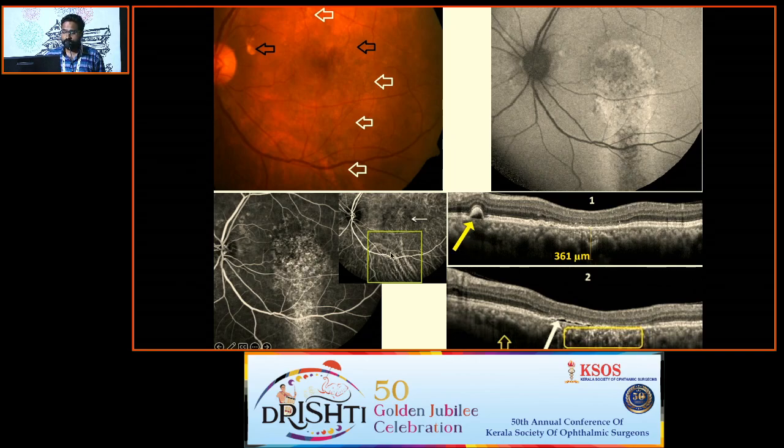Indocyanine green angiography shows dilated choroidal vessels along the tract as well as an area of hyperfluorescence in the macula. On OCT in these patients, there will be more RPE thinning, irregularity of the retinal pigment epithelium, small elevations of the RPE above Bruch's membrane, hyperreflective dots in the choroid, as well as collapse of the inner into the outer retinal layers.